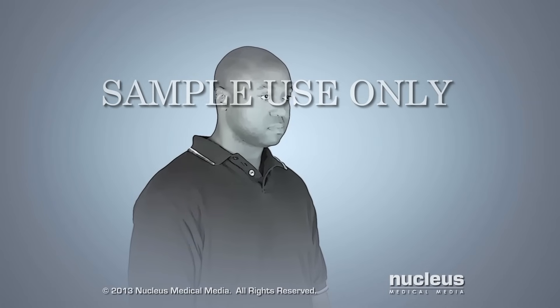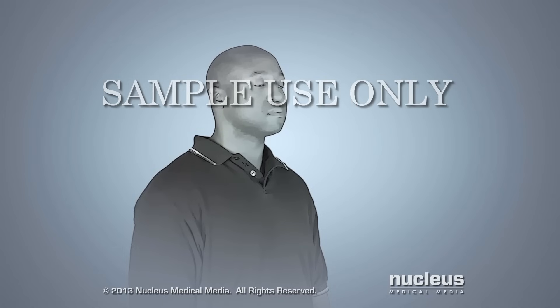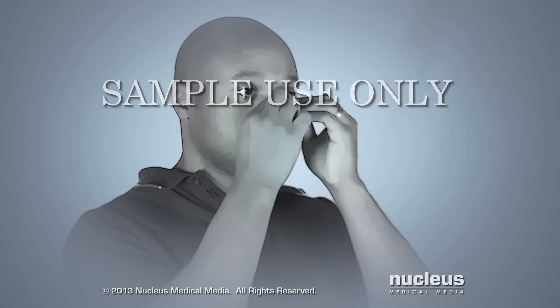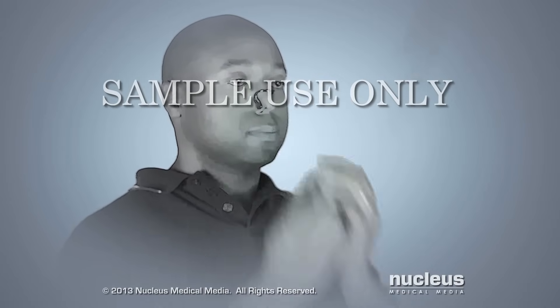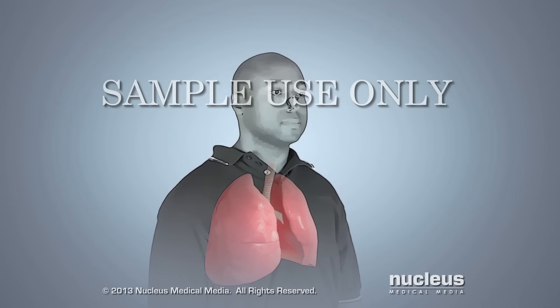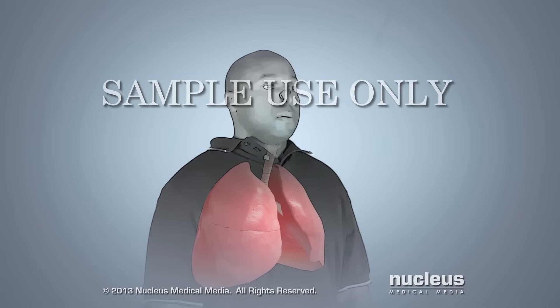To start, you will raise your head and chin so that you can breathe easily. Next, you will place a clip on your nose to prevent air from coming out of your nostrils. Then you'll take a deep breath, filling your lungs completely with air, and hold it.